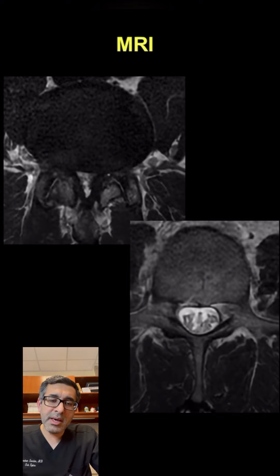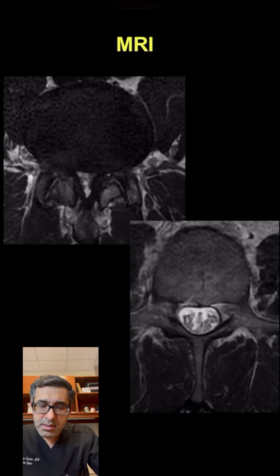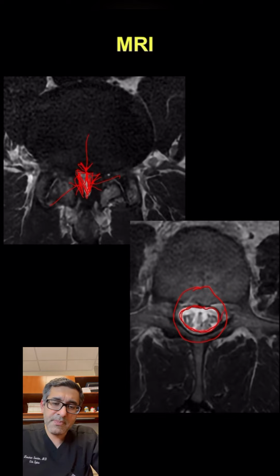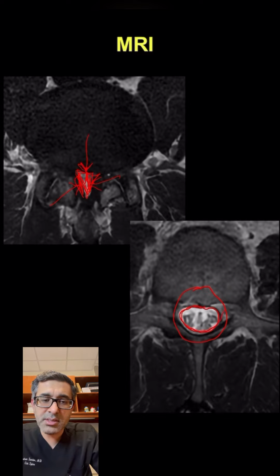And then on MRI scan, we assess for compression or the stenosis. Here on the bottom, this is what a normal spinal canal is supposed to look like, where you have all these nerves that are free and a lot of CSF around the nerves. But as you can see in this top corner, this patient has severe spinal stenosis where there's a disc bulge in the front that's compressing, and then you have ligament as well as facet hypertrophy from both sides that's really squeezing the canal so that you're left with this little triangular region as opposed to this large oval-shaped region for the nerves. And so that's spinal stenosis, and that's how it looks on the MRI scan.